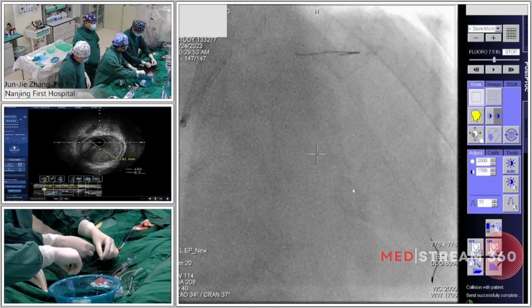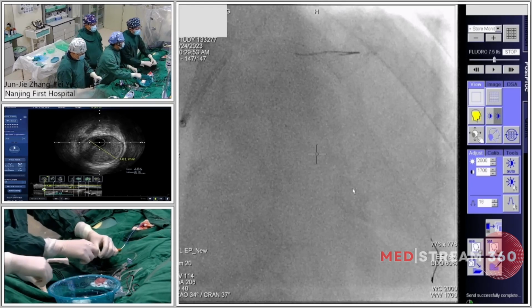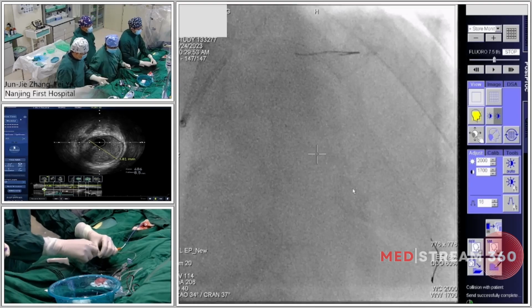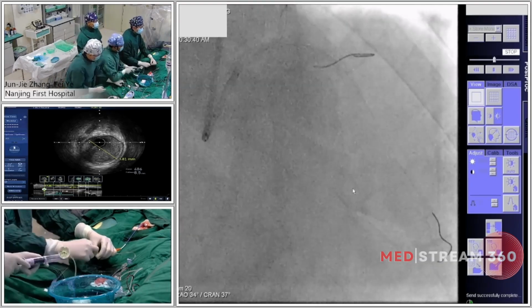Doctor, will you change your strategy? Will you use rotational ablation or laser therapy for this case? We can use a double channel catheter to make the buddy wire technique.